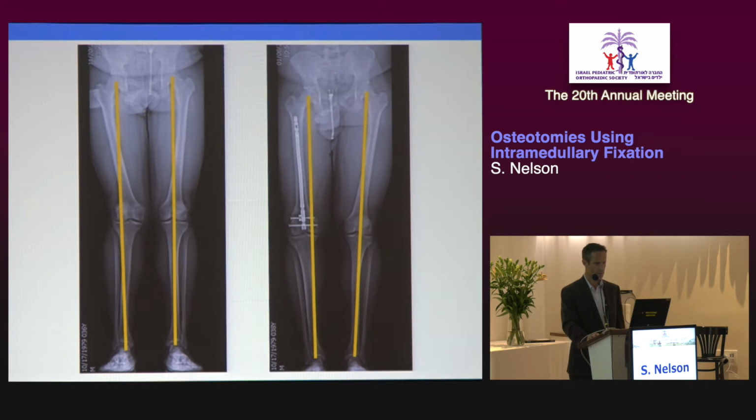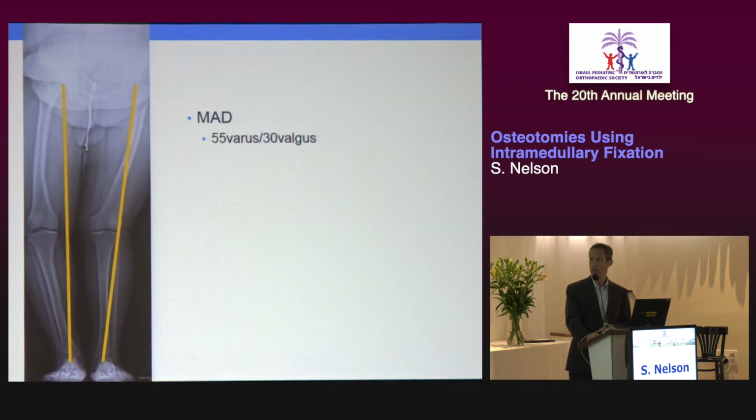And here is a pre- and post-operative image of this case. This patient had lateral knee pain with degenerative changes in the lateral compartment and chondromalacia. I did an arthroscopy first to assess exactly the status of the medial compartment and the lateral compartment and to decide exactly where we wanted that mechanical axis to fall post-operatively, which in this case was a little bit more medial than you might normally choose.